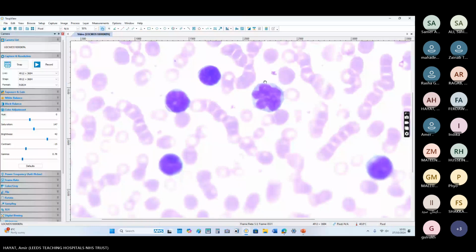Okay, so a flower. Some people say cauliflower, clover flower type of nucleus. Like that. But the main purpose of this blood film is that this is not ATLL. All of these nuclear material is in the form of this flower-shaped nuclei. But you never say this is ATLL on morphology or this is TPLL on morphology, etc.